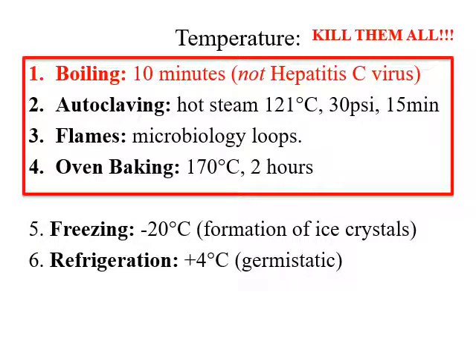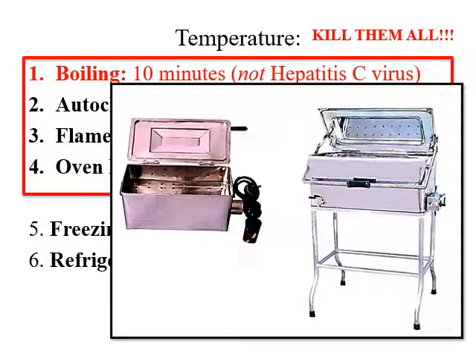All right, so as I said, boiling for 10 minutes is not always effective. That's why hospital instruments and dental instruments must be autoclaved. So this is an old-fashioned hospital boiling instrument. You plug it in, it's electrically heated, and the electric heat would boil the water. These are still used in some parts of the world. If they can't afford an autoclave, they might still be using commercial boilers, but be aware that that doesn't kill everything. In particular, hepatitis C sometimes can survive this treatment.